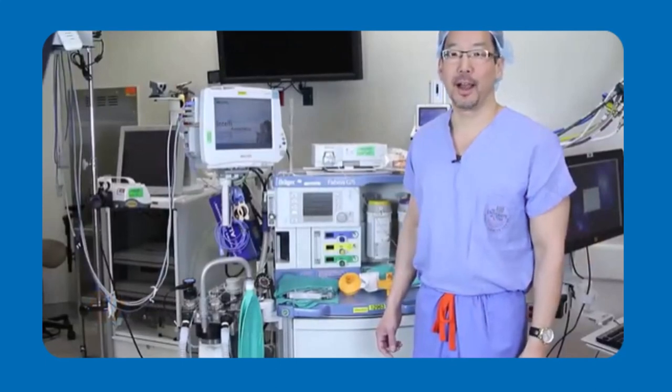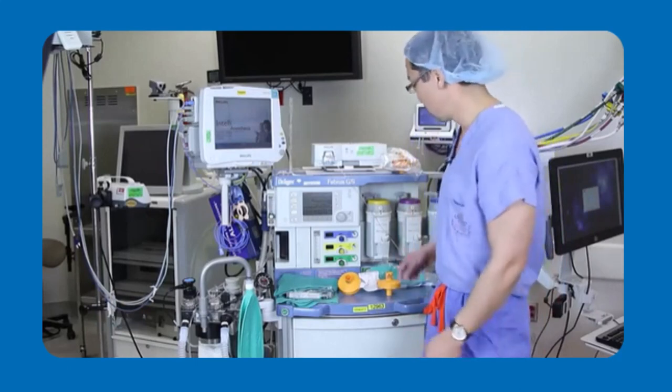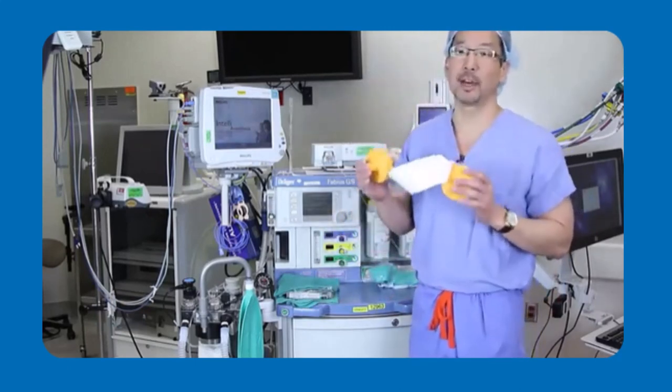Hello, I'm Dr. Derek Sakata. I'm a clinical anesthesiologist at the University of Utah. Today, I'm going to show you how to use the vapor clean filters in an actual MH crisis.